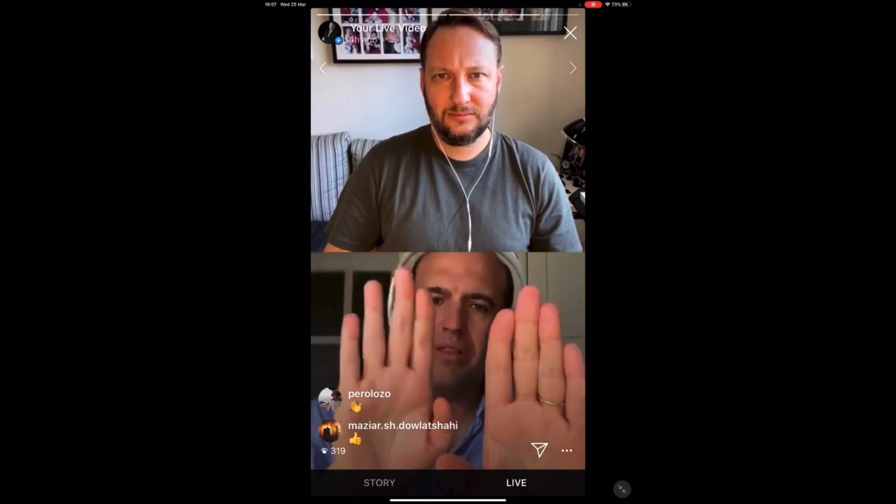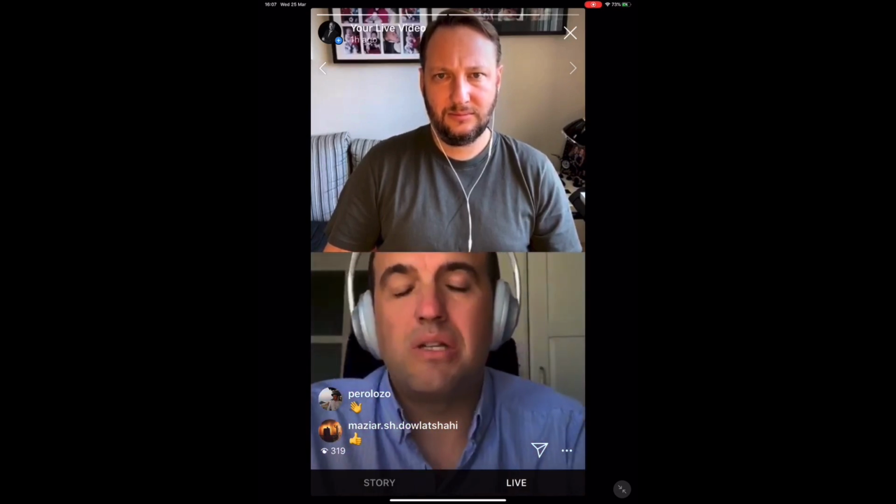After that, we are going to include some photo of a panoramic, to show that we have been studying not only extraoral, we have been studying extra and intraoral the case. And after that, we are going to put together the mock-up photography with the actual situation. So the most important thing in the video is not to show small dentistry details.